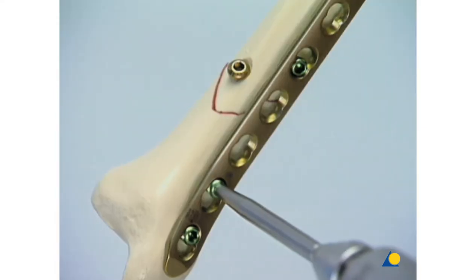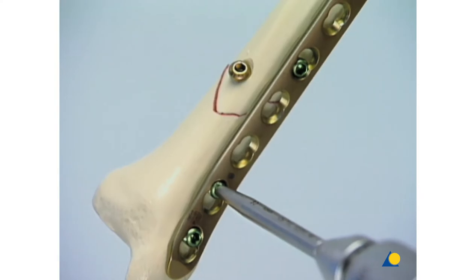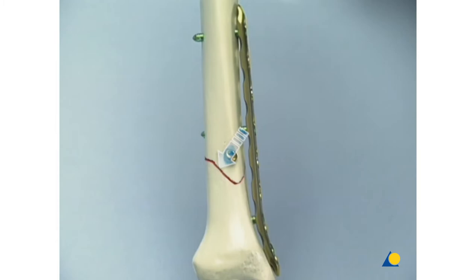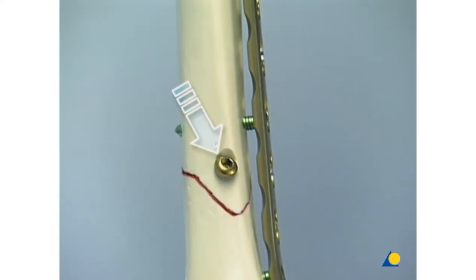To finish the fixation, one more locking head screw is introduced in the distal main fragment. A simple type A tibia fracture in the distal metaphysis has been anatomically reduced and fixed by an independent lag screw, protected by an LCP applied as a purely internal fixator. In the area of the fracture, the plate does not interfere with the periosteal blood supply, since it is not pressed against the bone surface.